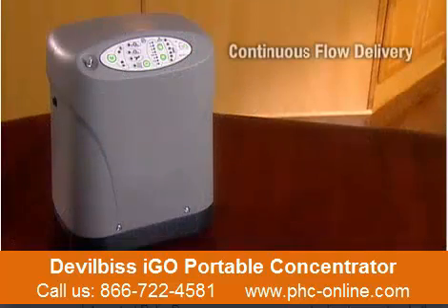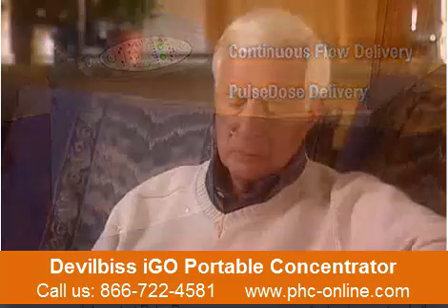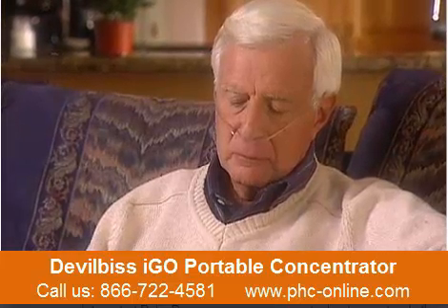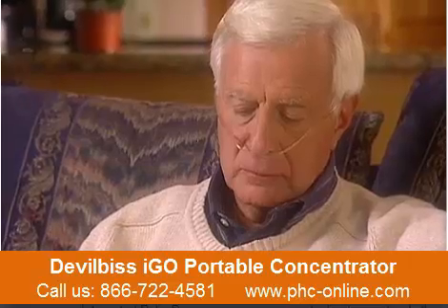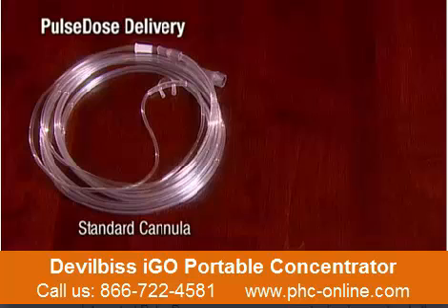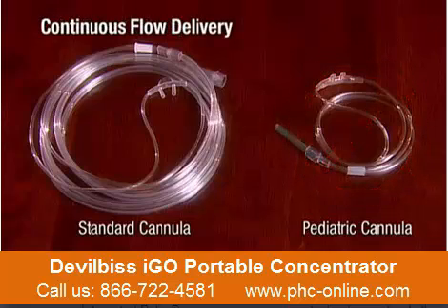The iGo system features continuous flow and pulse dose oxygen delivery, offering increased mobility and superior comfort. Pulse dose delivers oxygen in a very short puff, not continuously. The duration of each pulse of oxygen will not vary from breath to breath and is set in correlation to your prescription. As noted in your instruction guide, only standard nasal cannula can be used in the pulse dose mode. Pediatric low-flow cannula cannot be used. Any cannula can be used in the continuous flow mode.